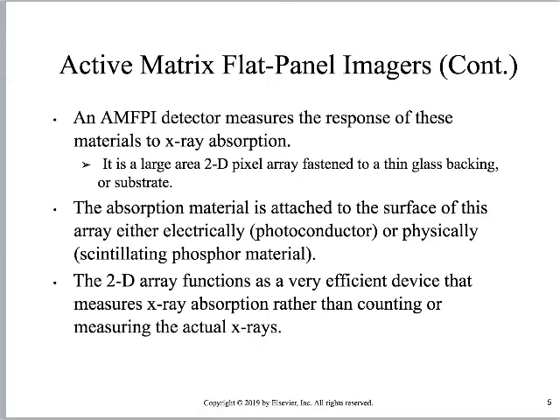So we have two houses, right? One house is full of light, like a greenhouse, right? It's full of light. That's that indirect system. We have another house that is just full of electricity. It's an electrical house, right? But the foundation work is exactly the same. That foundation, that active matrix, is essentially the same, okay?